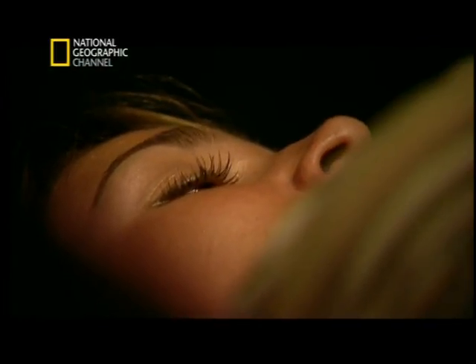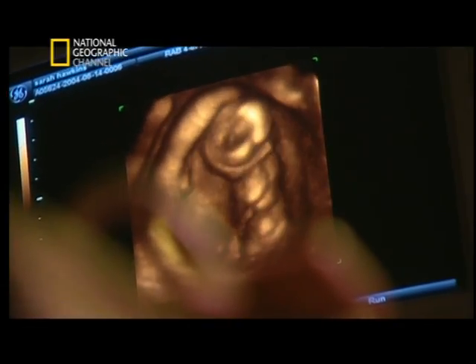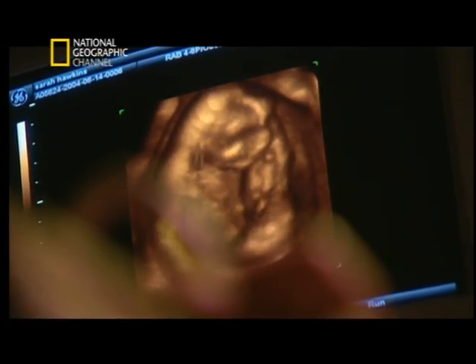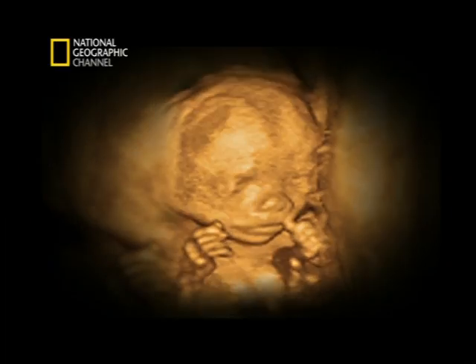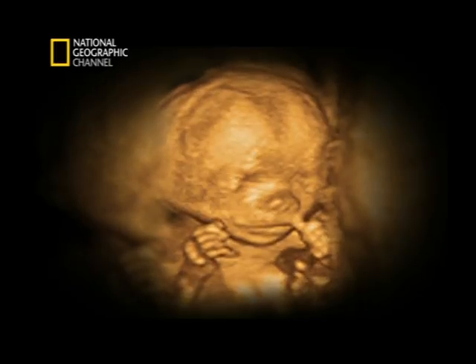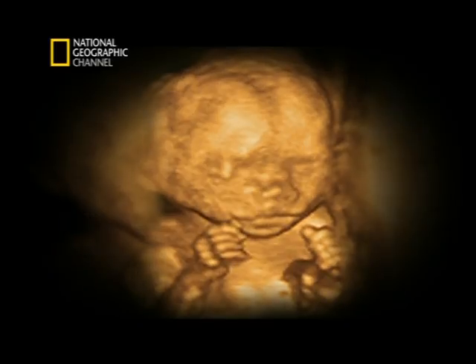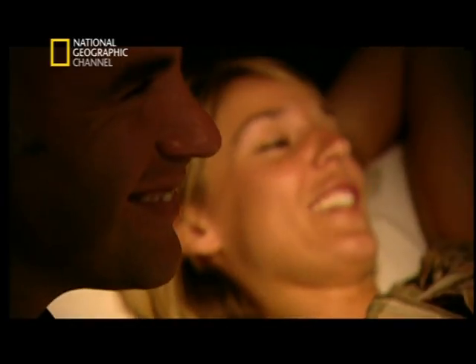But doctors have discovered a beneficial role the scans can play in developing a bond between the baby and her parents. There's the arms going down by the side. See that? See there? And now the baby's kneeling. You see that? Yeah. Research has shown that seeing your baby's face and expression while it's still inside the womb can be an intense experience. And such early bonding can provide an important boost to the baby's development once it's born, and to the long-term relationship between the child and her parents. And that's the arms there.